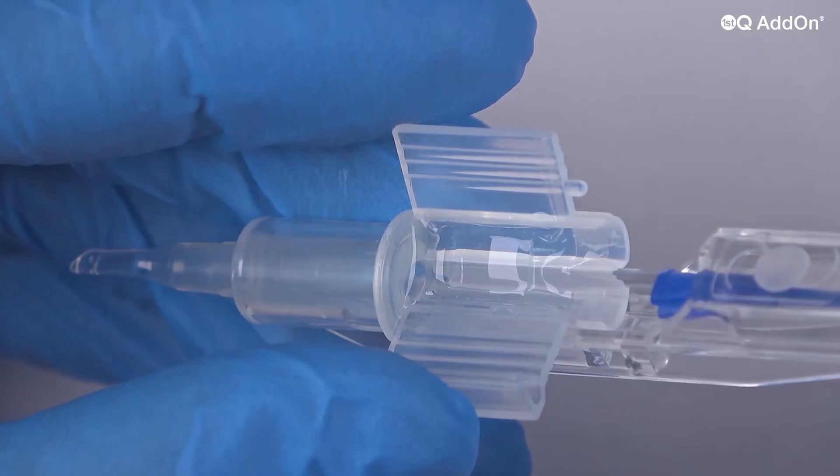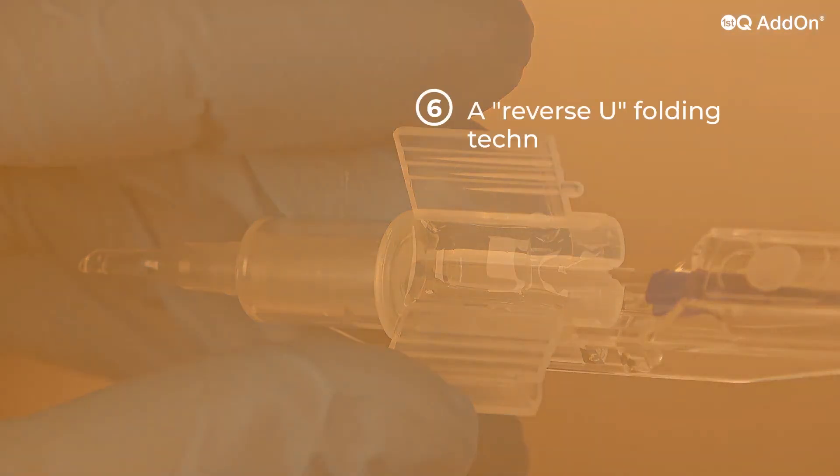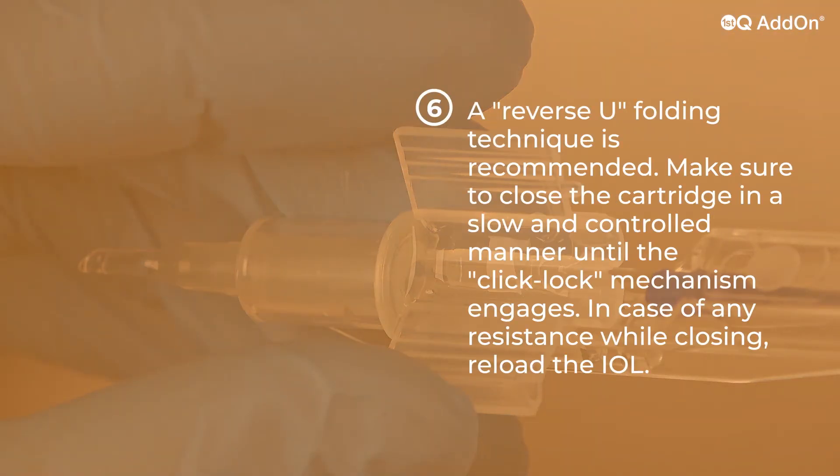To ensure a downward exit of the leading haptics from the nozzle, a reverse U-folding is recommended. Observe the shape by slowly closing the wings.